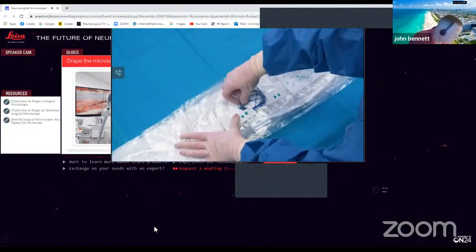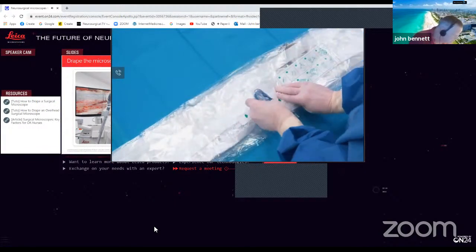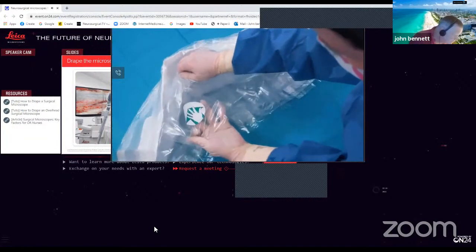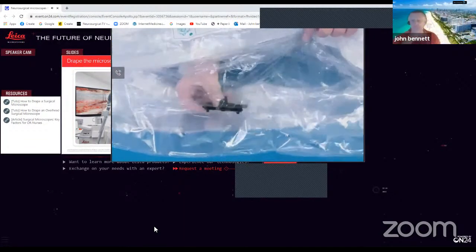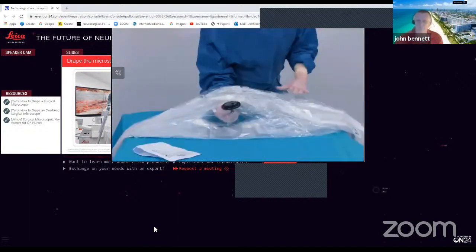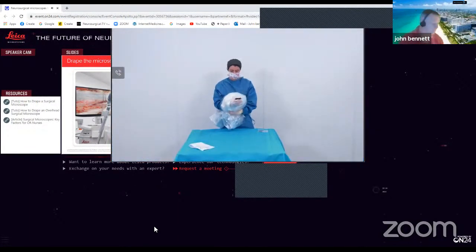You will find several rubber bands. Detach them and keep them with you, as they will later be useful to help secure the drape. Find the hand sticker and slide your hand inside the drape to find the lens cover. Hold the tab containing the white dot with your thumb and the other tab with your index finger. Lift the lens cover at the same time as the remaining drape.